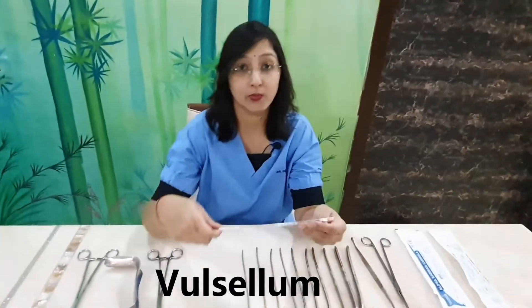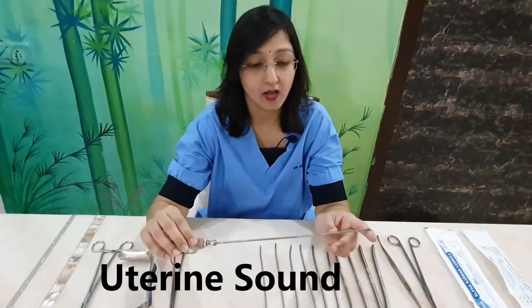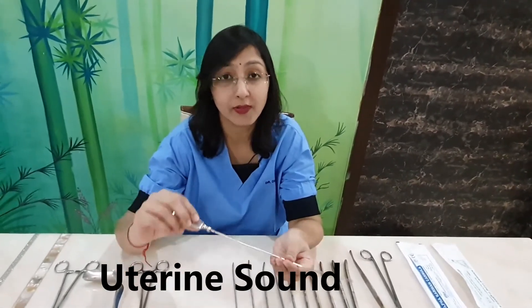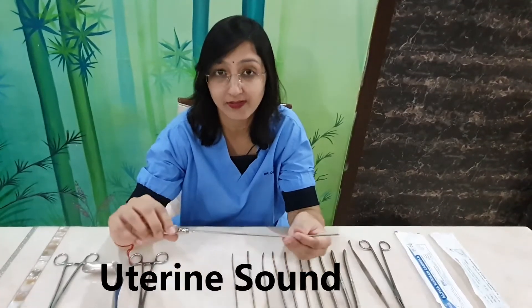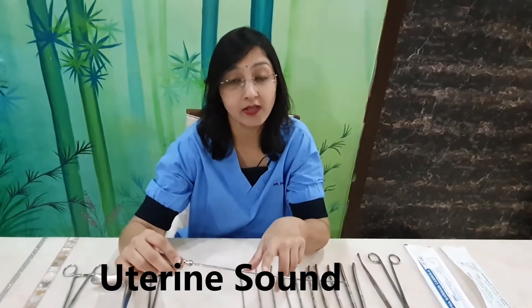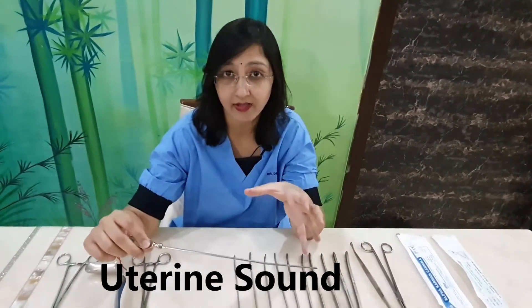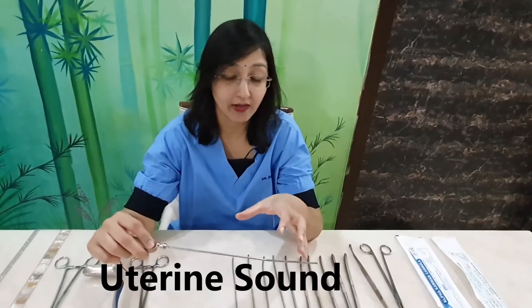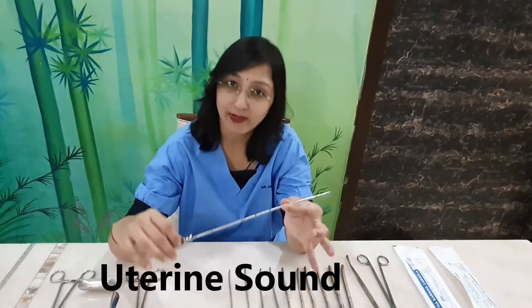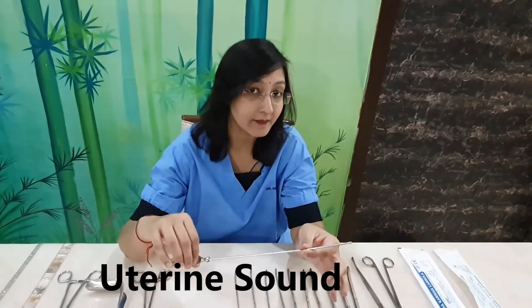After that we use the uterine sound. All these are metallic instruments. The uterine sound serves two purposes: first, it helps determine the direction of the uterus — whether it is anteverted or retroverted. Second, it has markings on it that help us know the length of the uterine cavity, so we have a reference before introducing further instruments. It also acts as the first dilator.